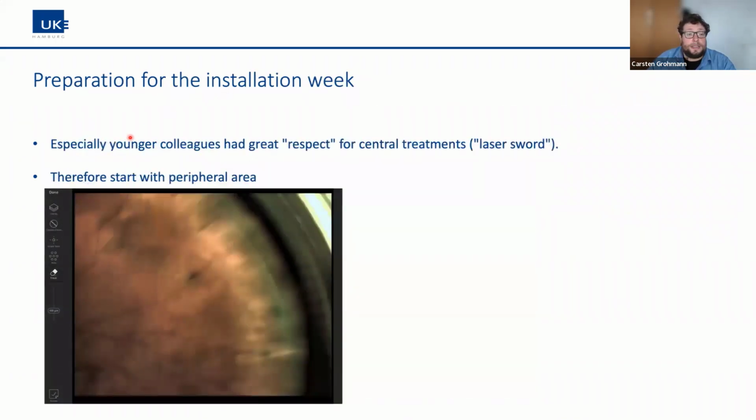And especially the younger colleagues had great respect for central treatments because they compare a laser with a laser sword, like in movies seen. But when you secure the fovea and also the optic nerve head with the caution zones, I think they feel much better for the central treatments also.